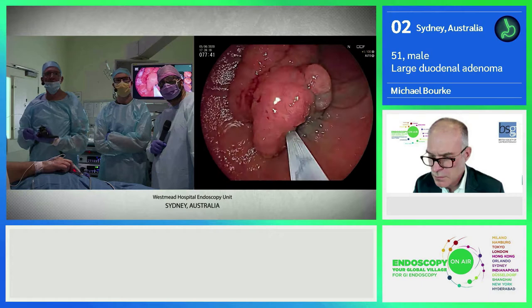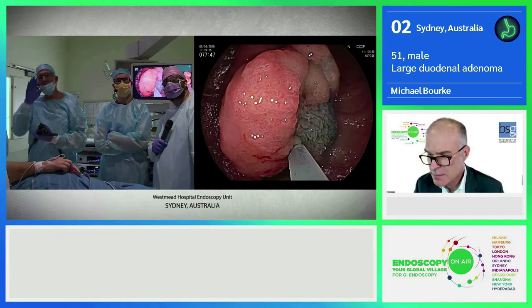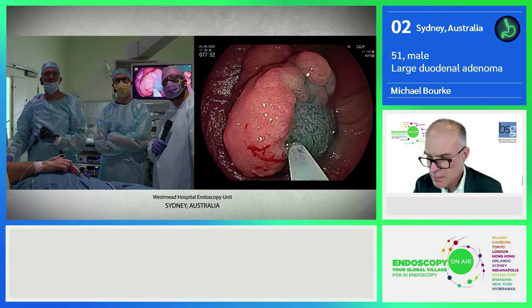So see, originally, we didn't get a lift straight away. You must get an immediate lift. Go. Okay, go more.